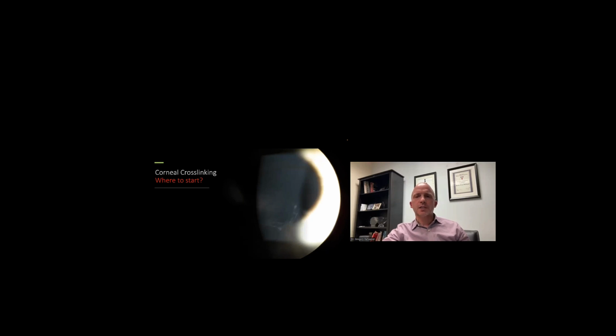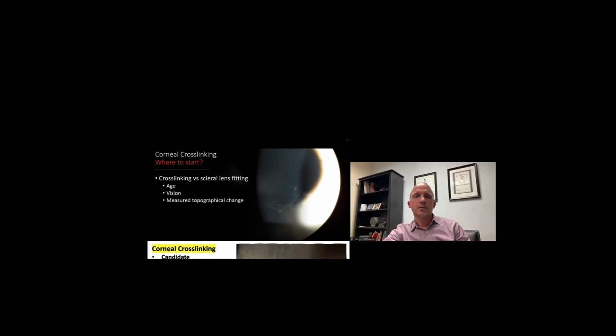And I have patients that come to me for scleral lens fitting, and sometimes they've had cross-linking and sometimes not. Sometimes, in fact, they've not even been educated about what cross-linking is. So we always have to look and make sure whether the patient is or potentially is not a candidate for cross-linking first. And of course, some of those variables in that determination include how old are they, what is their vision, and of course, measured topographical change.